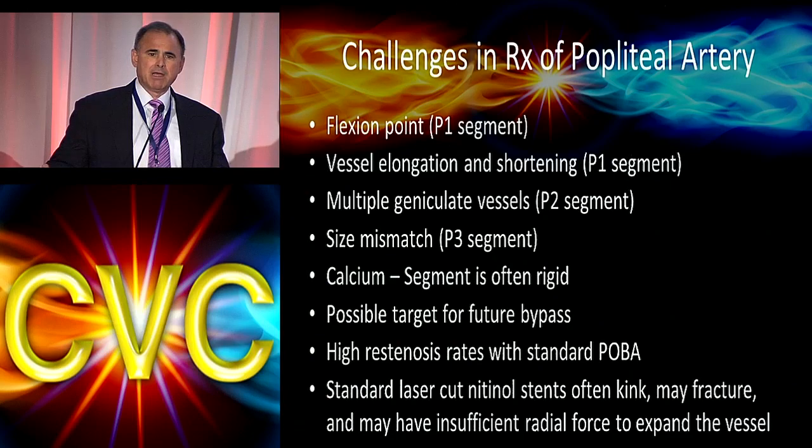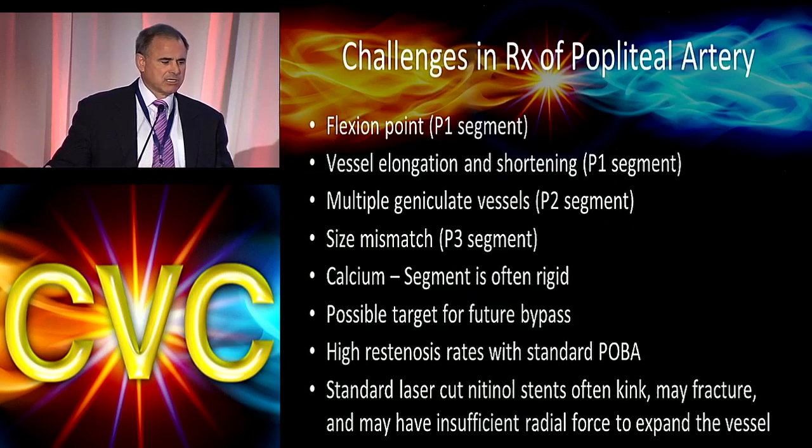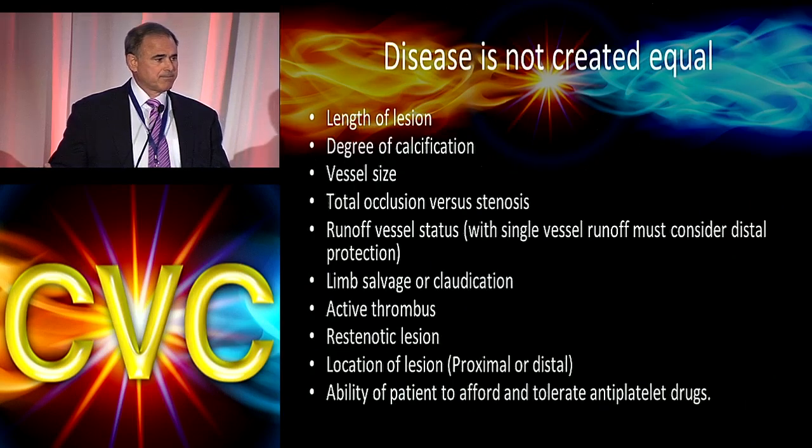We must keep in mind these sites serve as future targets as well as origins of bypass grafts, which may be crucial. There have been historically incredibly high rates of restenosis with standard balloon angioplasty, and standard laser cut nitinol stents often kink, may fracture, and may have insufficient radial force to deal with treating this segment.